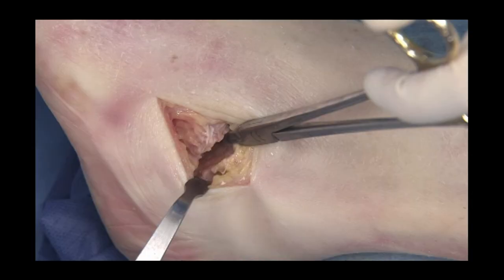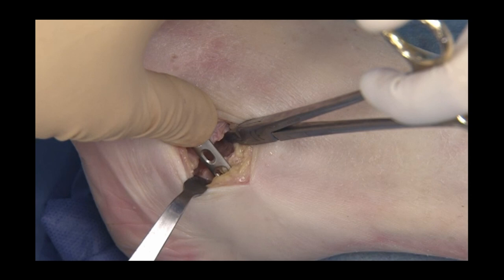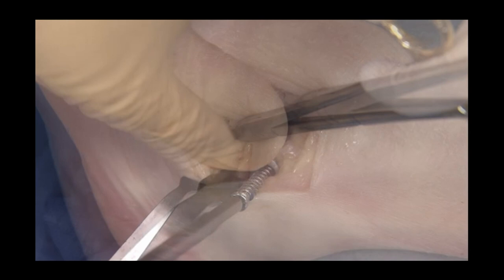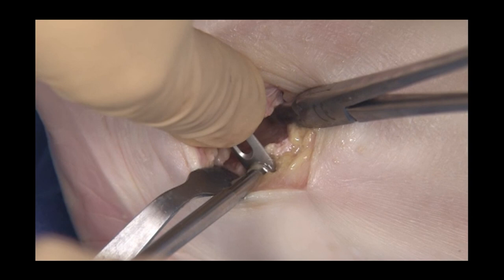Appropriate opening wedge osteotomy is maintained with some sort of wedge positioned at the Gissane angle. Here, a needle holder has been used to maintain the gap. One can use a quarter tubular plate or a utility plate with two to four holes, depending on the stability required by the construct.